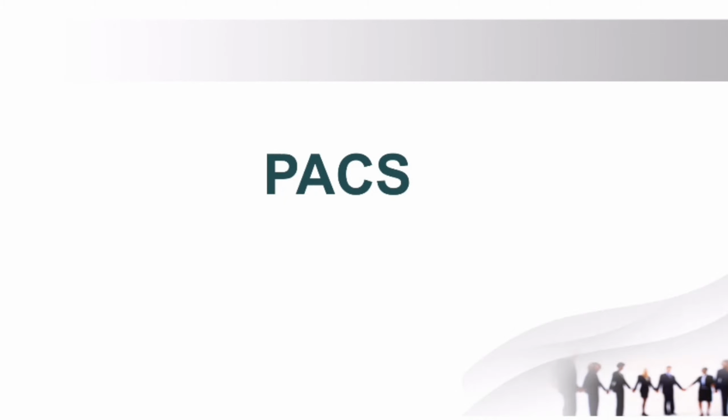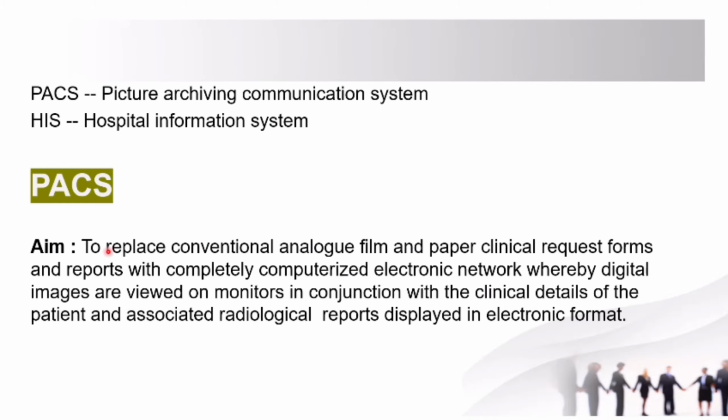Hello everyone. So today's topic of discussion is PACS. PACS stands for Picture Archiving Communication System, and we also have HIS, which stands for Hospital Information System.